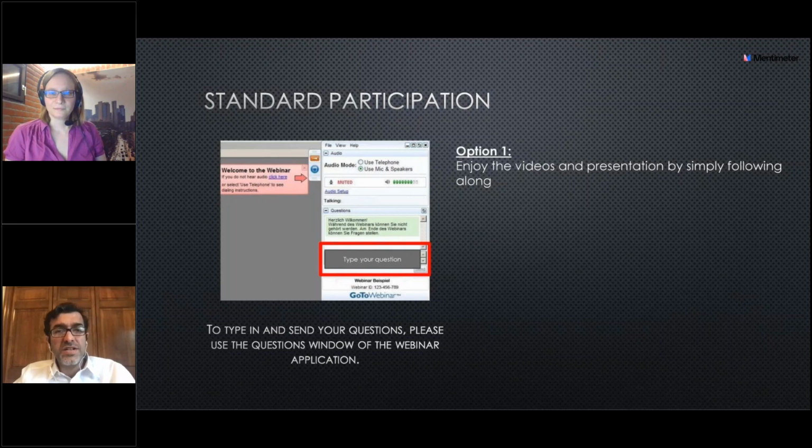the laser session, which tells you which exact areas you did the laser. So whenever you're repeating a fluorescein because of a recurrence or persistent fluid, you know which area you treated and which area is now leaking. So do I really need to go back and treat that part? In addition, PDT is now not available in many countries. In the United States, we do not have PDT in many states, but subthreshold laser is increasing, and I hope that eventually we would move everybody to subthreshold laser, which could be a much safer way of treating our patients. Thank you.